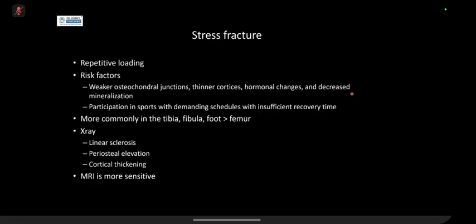I think all the other things you're thinking about, infection, even osteoid osteoma, are very important differentials. MR would help you to delineate the extent of marrow involvement, and then if you're still in doubt, do a CT for characterization. I think in kids, if you don't find the answer with a single modality and you think it could be certain other differentials, consider CT. Although there's radiation, it can help you narrow down your differentials. I'm not saying to do it in every one you don't have an answer for on MRI, but if you have a potential differential, some of which can be excluded on CT, like osteoid osteoma, do it. Okay.